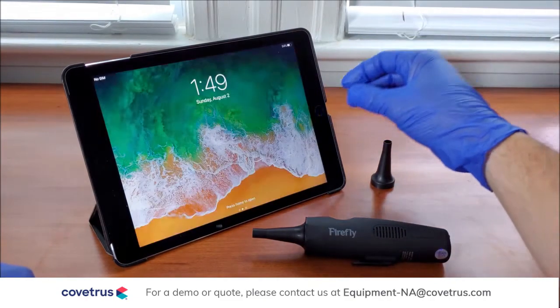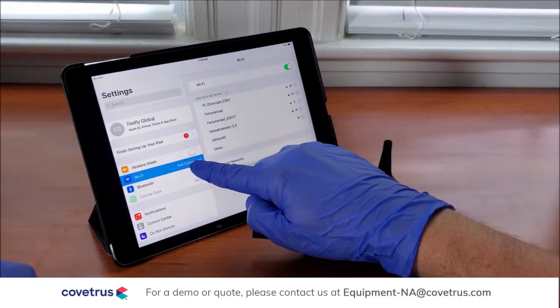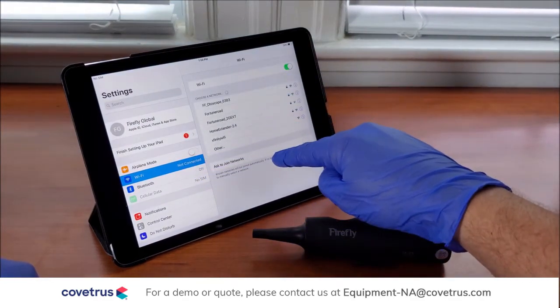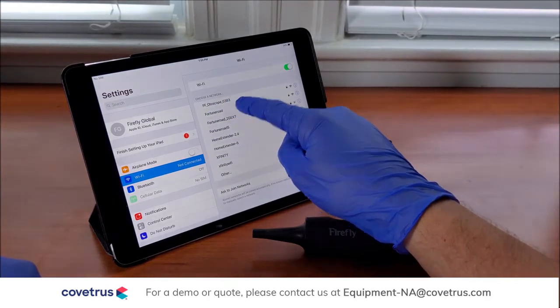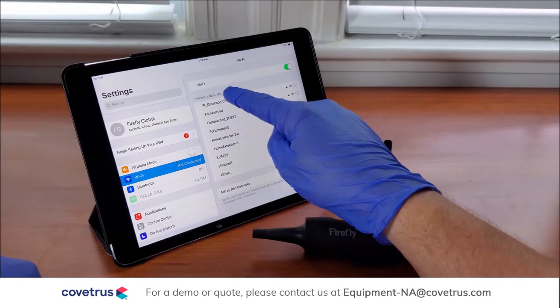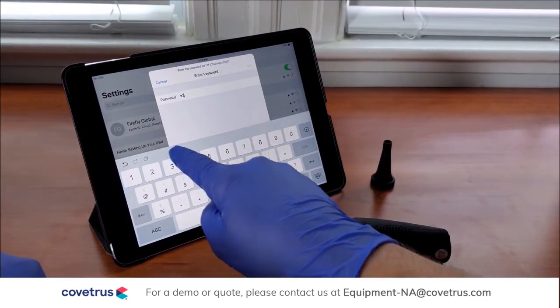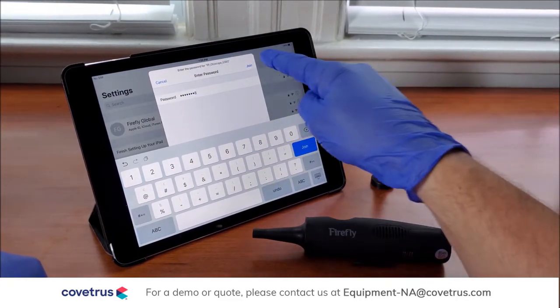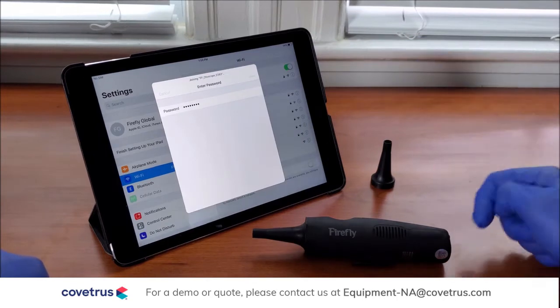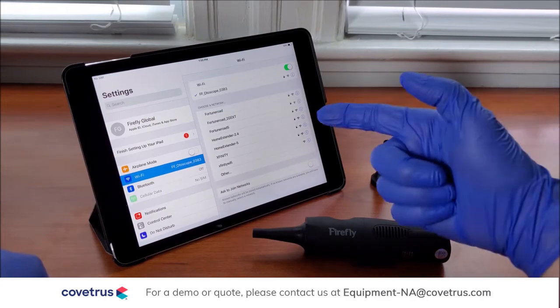We then turn on your tablet, go to Settings, and go to Wi-Fi. This will give us a list of Wi-Fi connections, and you'll see your Firefly otoscope in the list — it will start with FF. Press the device and enter the password that came with your camera, then press Join, and now your device and the iPad, iPhone, or Android-enabled device will be paired.